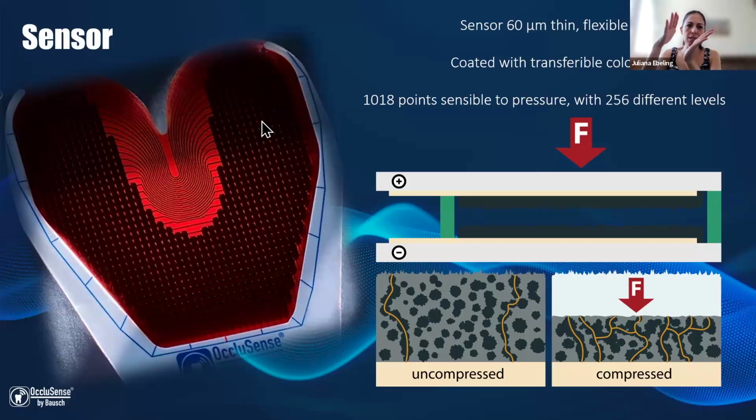We have two sheets with electrodes between them. It's like a leaf, and when they prepare this sensor, we have a lift, and then they close these two sheets with the electrodes between them. So we have the positive side here and the negative side on the other sheet.